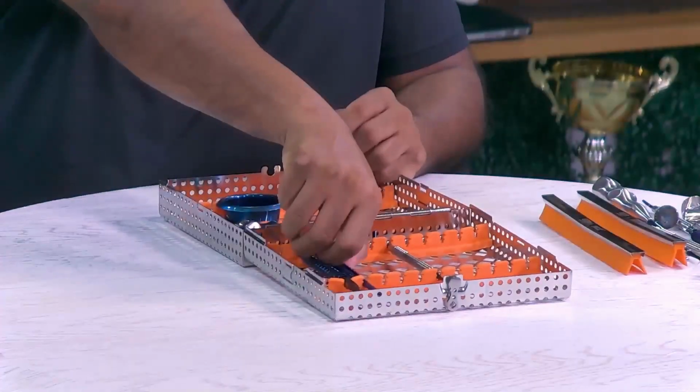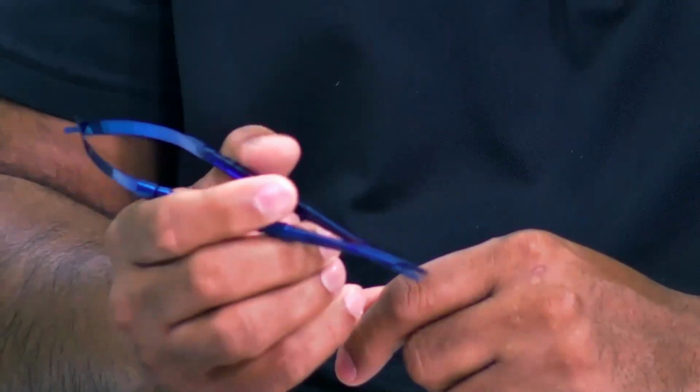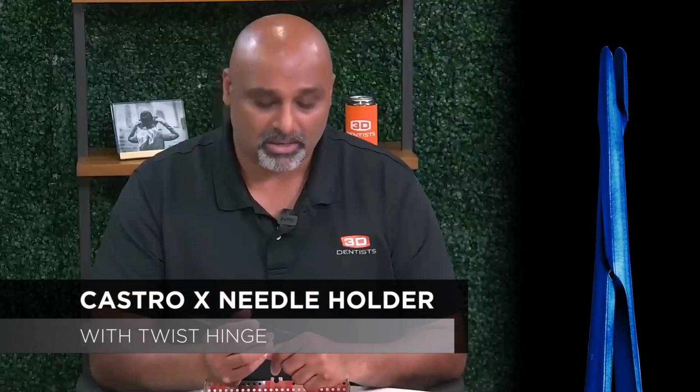The next instrument we have, when we're finishing up and going ahead to do our sutures, is a set of Castro needle holders. This was a little bit of an area where I initially wanted standard needle holders, but once I got used to using the Castros, the flexibility, the ability to do fine suturing, the ability to manipulate this and move it around in the posterior area of the mouth, and as you get into more complex surgeries, I find that the Castro needle holders are invaluable and great to do that.